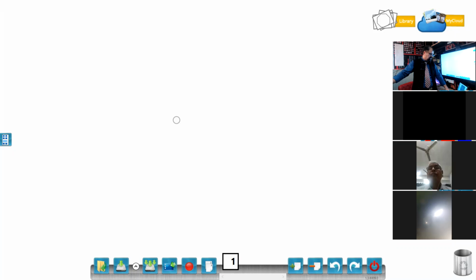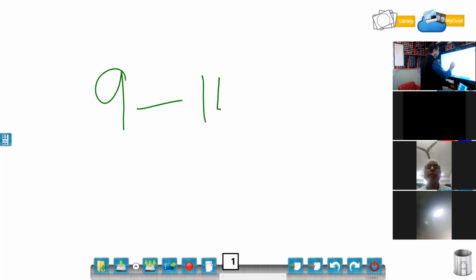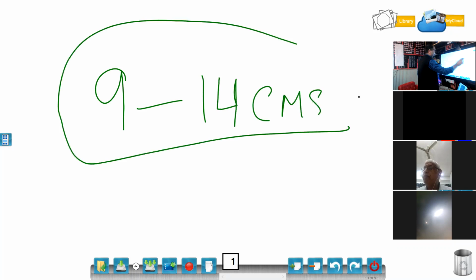What are the more important points? The kidney length. How much is the kidney length? Kidney length is between 9 and 11. No, 9 to 14 centimeters. Now it depends on whether I am dealing with a short stature patient, or the habitus of that patient is very big.